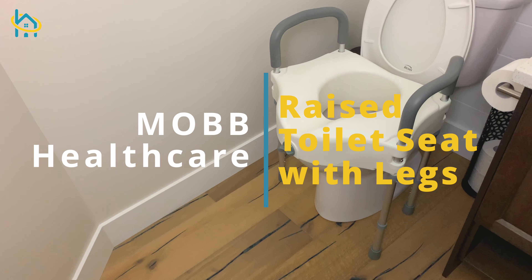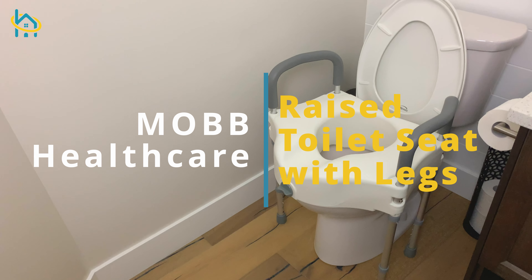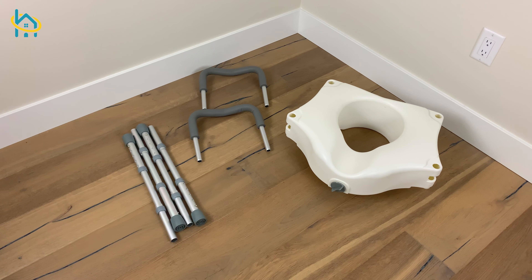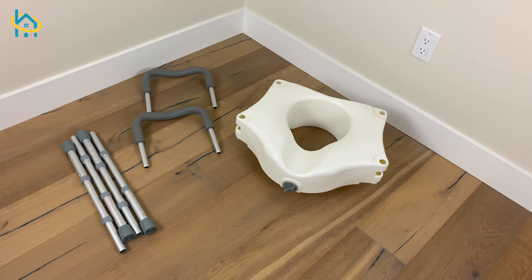If your low toilet seat is causing you to feel unsafe at home, the MOB raised toilet seat with legs will help give you your confidence back. Let's go over how to set it up.